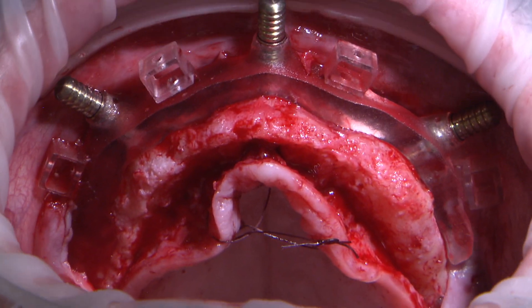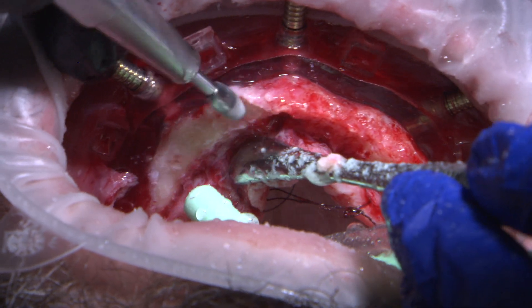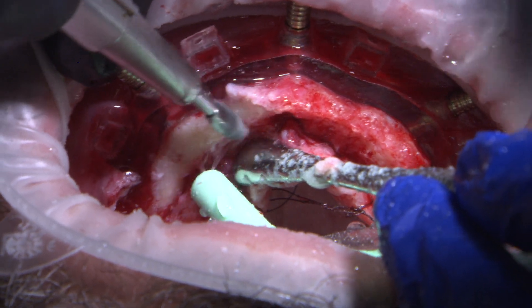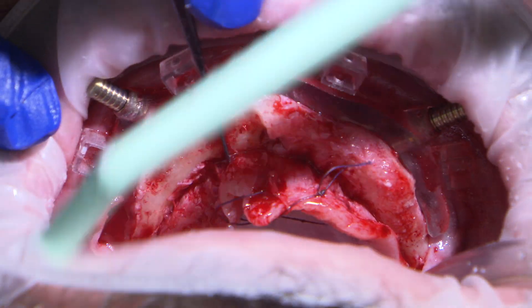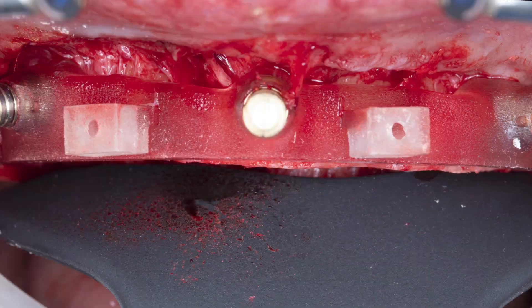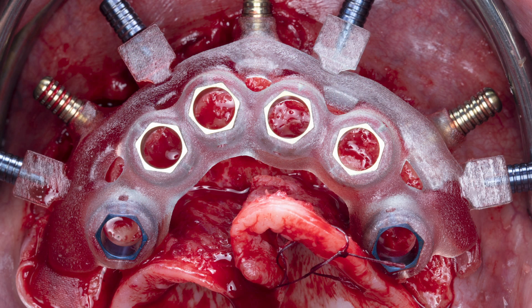The platform of the foundation guide is then utilized for bone reduction. A flat instrument can be used to verify the bone reduction and make sure it is even with the flat surface of the foundation guide. The osteotomy guide is then seated on top of the foundation guide and the same blue interlocking pins are reinserted to secure this portion of the guide in place.